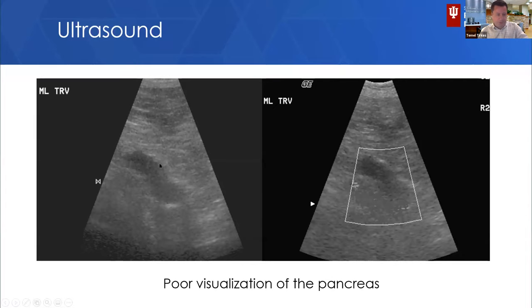You can ask, what am I looking at here? And I will tell you the same thing. This is actually a pancreas ultrasound in a patient with acute pancreatitis. All you are seeing in this snowstorm appearance is peripancreatic fluid, basically, in a patient with acute pancreatitis, but you really cannot make out where the pancreas is. The main reason for that is this patient has a lot of subcutaneous fat and the pancreas is located deep in the abdomen. Therefore, the sound beams do not penetrate as deep as needed, and you get really limited anatomical detail.